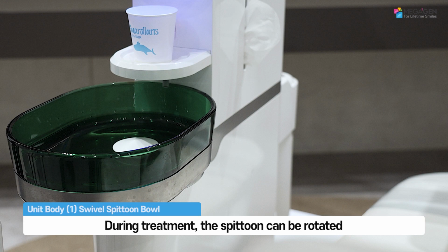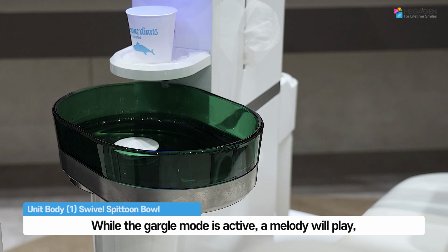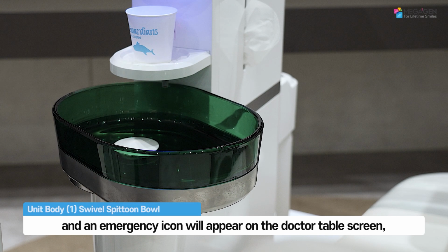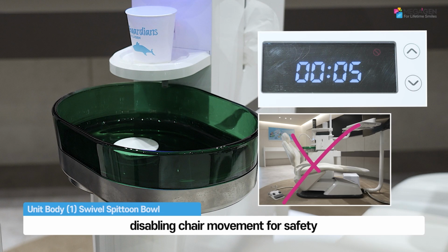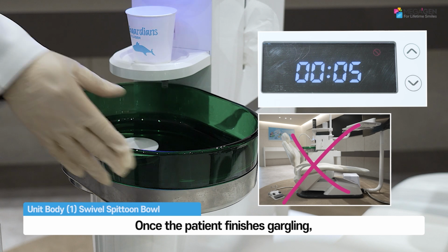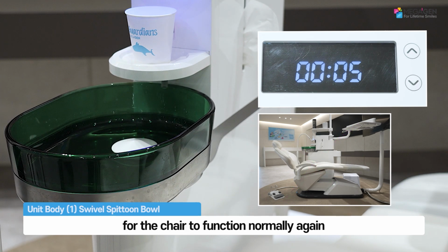Spittoon gargle mode. During treatment, the spittoon can be rotated towards the patient to make gargling easier. While the gargle mode is active, a melody will play, and an emergency icon will appear on the doctor table screen, disabling chair movement for safety. Once the patient finishes gargling, the spittoon must be returned to its original position for the chair to function normally again.